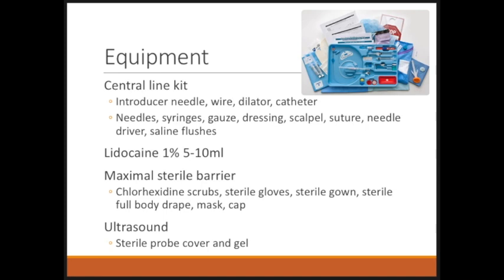One important thing to emphasize is maximum sterile barrier technique, specifically bathing the patient in a wide area of chlorhexidine scrubs repeatedly if necessary, and maintaining sterile gloves, sterile gown, sterile full body drape, as well as a mask and cap. And be sure to grab your sterile probe cover and gel as well.